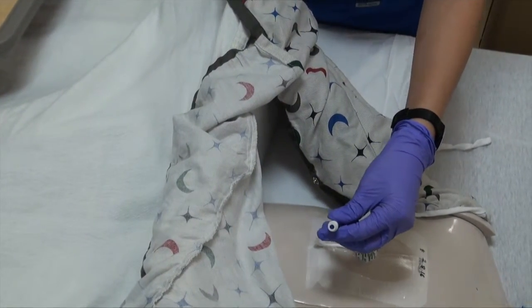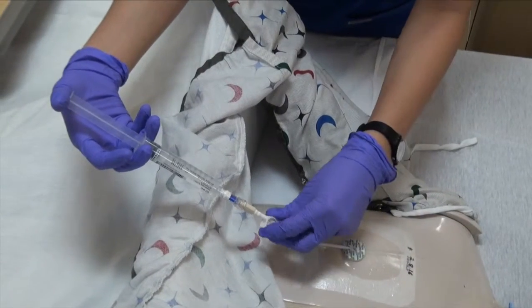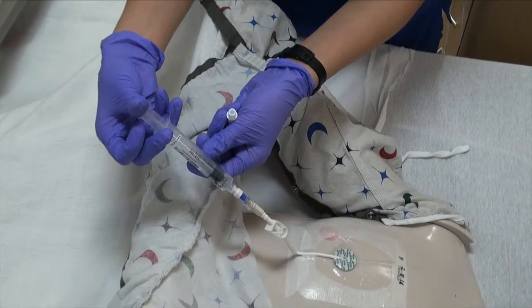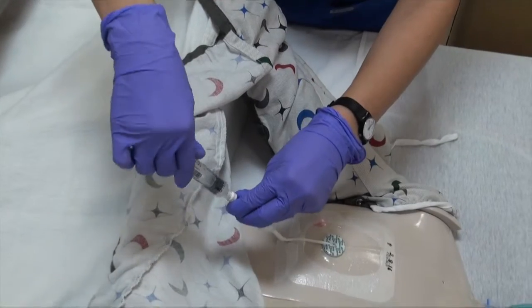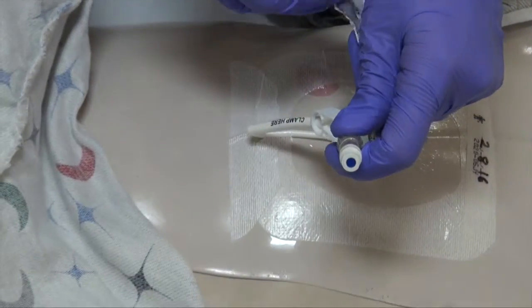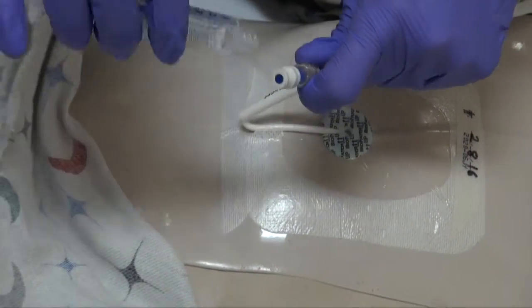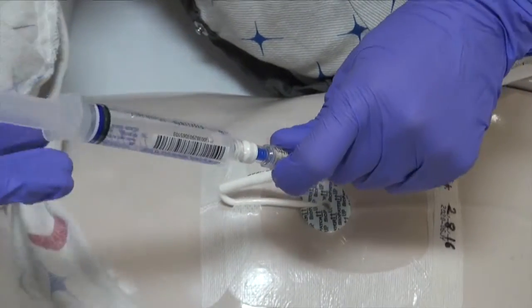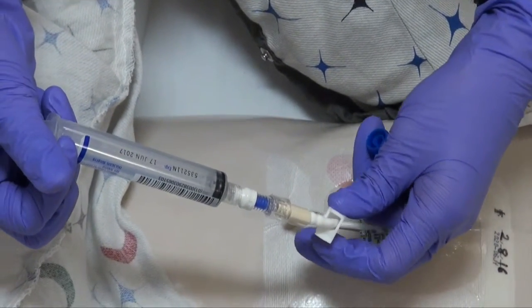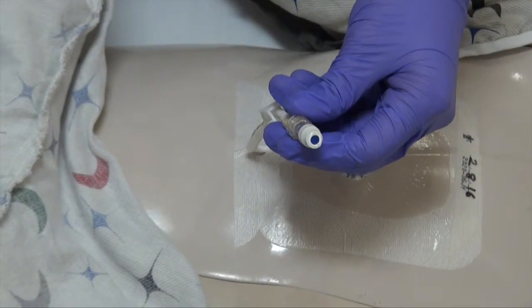Ensure that you unclamp, flush, and reclamp the line prior to removing the sodium chloride. Using a new CHG wipe, wipe the line again for 30 seconds and allow to dry before using heparin, following the same instructions as the sodium chloride. If the lumen will not be in use, apply a Curos cap.